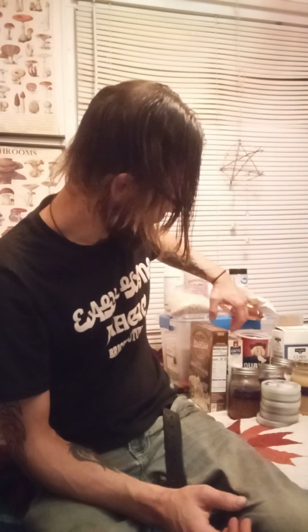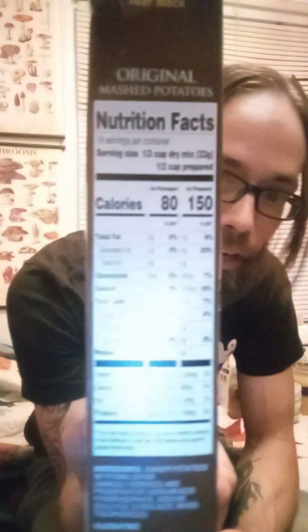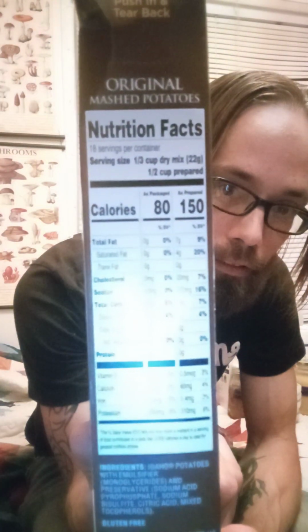I'm going to do the grits last. And then we have potato flakes. These are really, really popular, PDA. See if the camera can get that there. Okay, so 22 grams. We're going to have to multiply everything by 4 to get close. That way we can kind of compare with everything else.